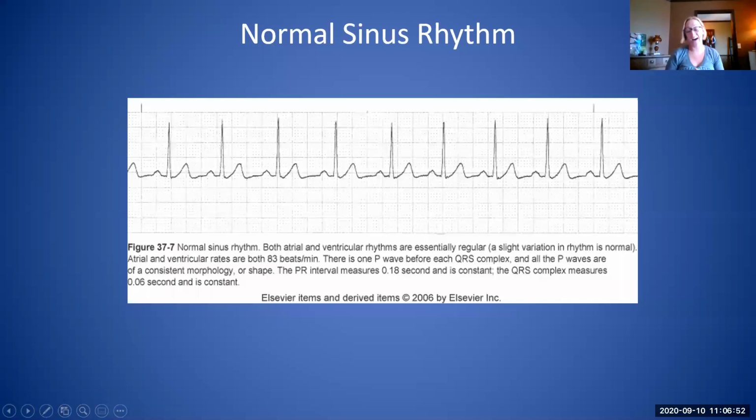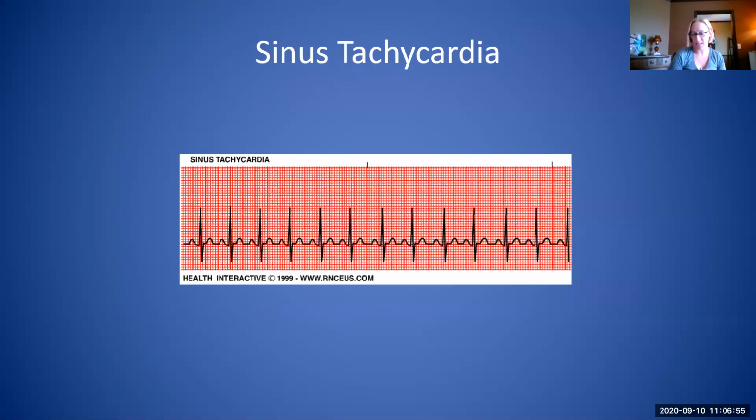I don't have an actual good reason as to why some do and some don't, but it's normal. The widening is what you want to look at the most when it comes to the QRS. That isoelectric line doesn't really pertain to the QRS itself, just the ST segment is the main thing. But some are even, some go down. Sometimes it depends on the placement. The lead placements too can cause a little bit of differentiation in the way a rhythm looks, but it doesn't signify anything.